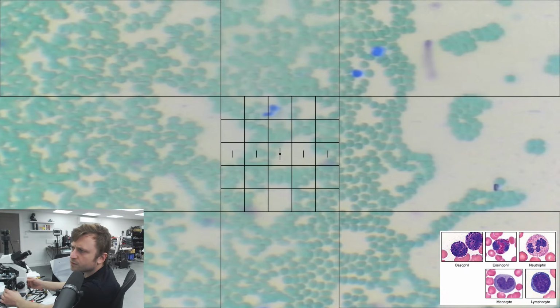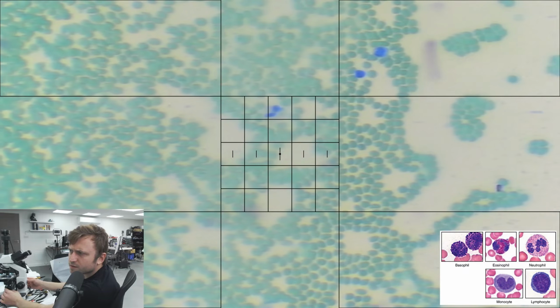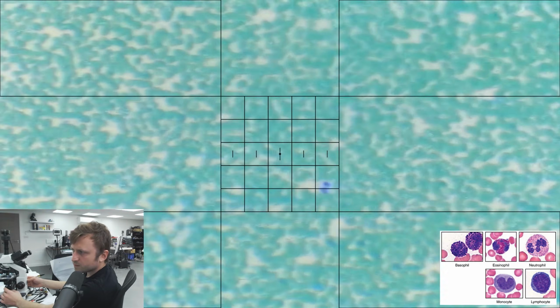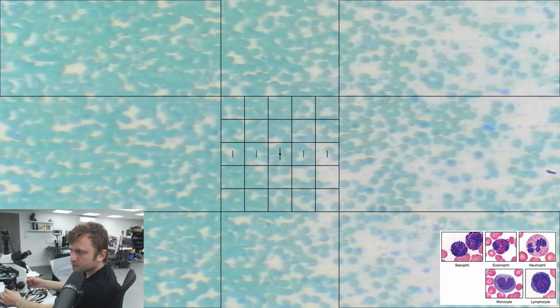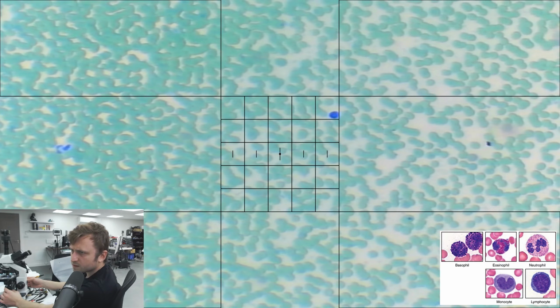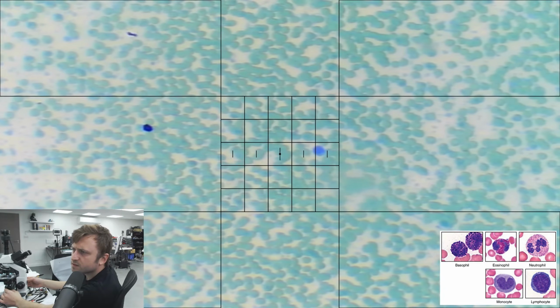Okay, next row. Is that a neutrophil? I can't see a boundary for it. I'll put that under unknown. Debris, erythrocyte, many. Neutrophil, gone by. Scanning, debris, scanning, more debris. Don't know whether to consider that as one. Lymphocyte. We move down. Lymphocyte.